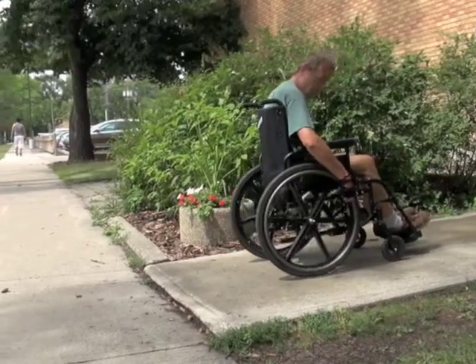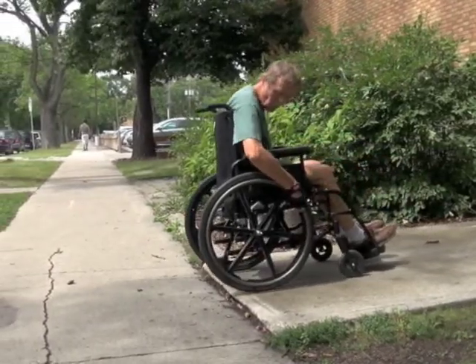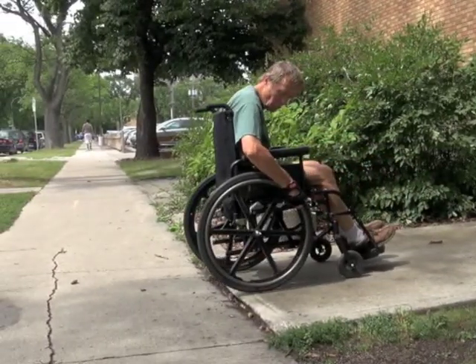Begin by turning your wheelchair so the drive wheels are leading towards the edge of the obstacle. Looking over your shoulder, propel backwards until the drive wheels are close to the edge. Make sure they are an equal distance away so that one wheel does not go down before the other.